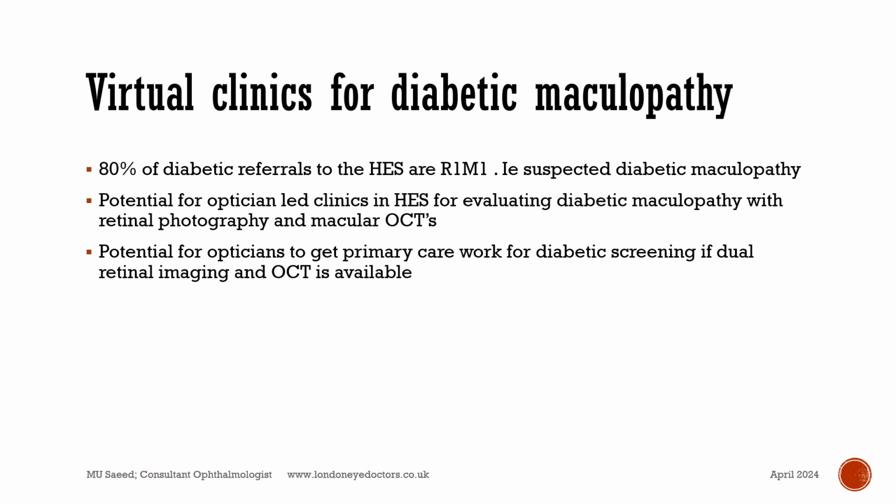These are instances where patients come, have an assessment with the nurse regarding their visual acuity, intraocular pressure, have a dilated retinal imaging with an OCT and an Optos camera, and then the patient leaves without seeing the doctor.